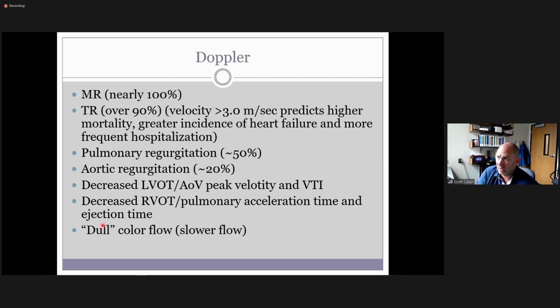Like if you come off of, for example, your pulmonary vein, where sometimes people will drop their color scale. Often people do that. I personally don't very often. But if they drop that down and then all of a sudden they go to the aortic valve next, it's going to alias because we didn't change our color scale back to the normal setting. So you've got to be careful of those things. Opposite of that, say I had come across a hypertrophic cardiomyopathy, or I had a HOCM situation. I know we haven't talked about this yet, but as I get into those situations, I may increase my color scale to really pinpoint what's going on.